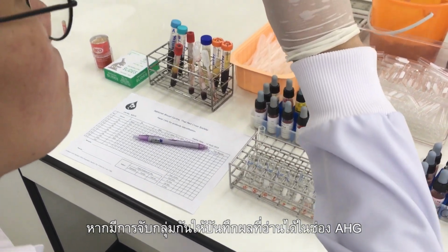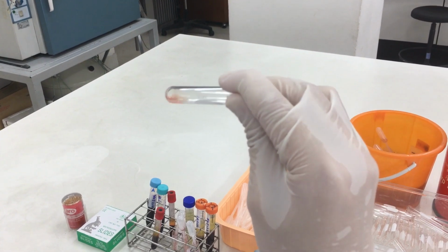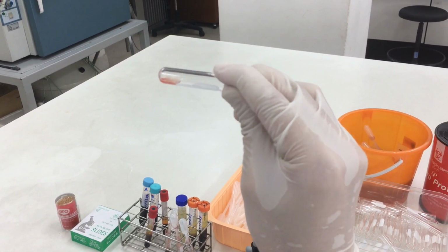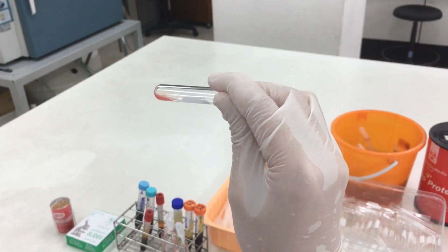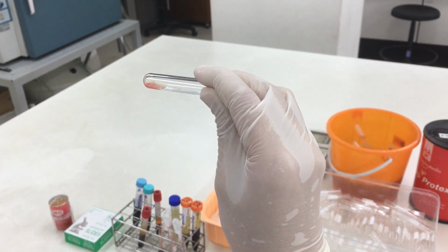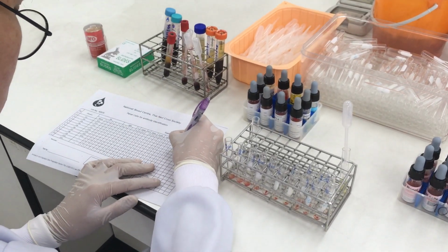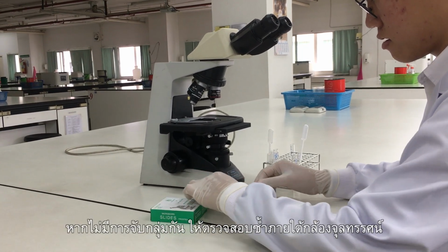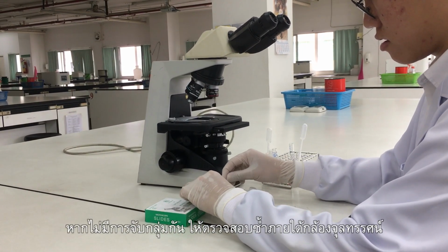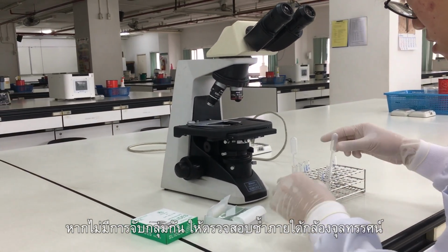If agglutination is observed, grade the reaction and record in the anti-human globulin phase. If there is no agglutination, confirm the negative reaction under the microscope.